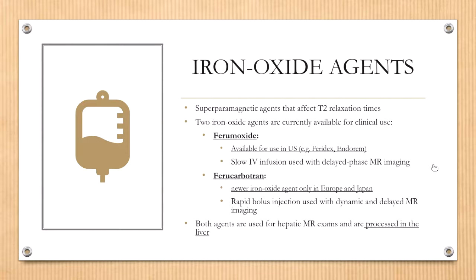So it's going to be the same type of phasing of image acquisition, except that it is going to be with the patient attached to an IV for quite a while.